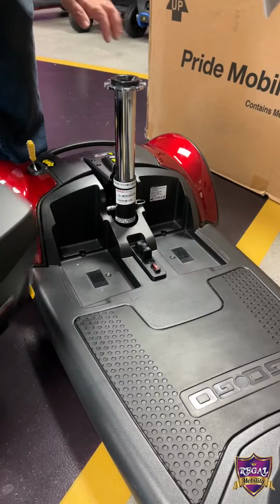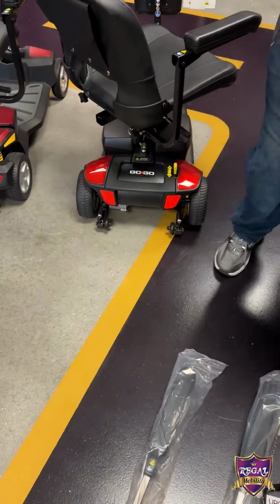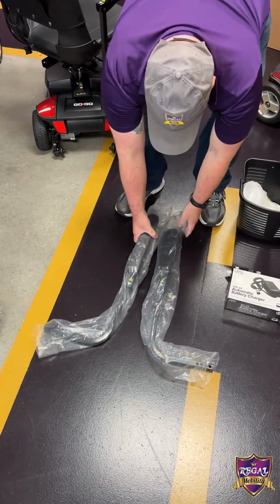Next up, grab the battery and place it into the designated battery cutout on the floor of the scooter. Now, grab your chair and lower it into the seat post. The seat should also lock automatically. Now we're almost there, just a few more steps.